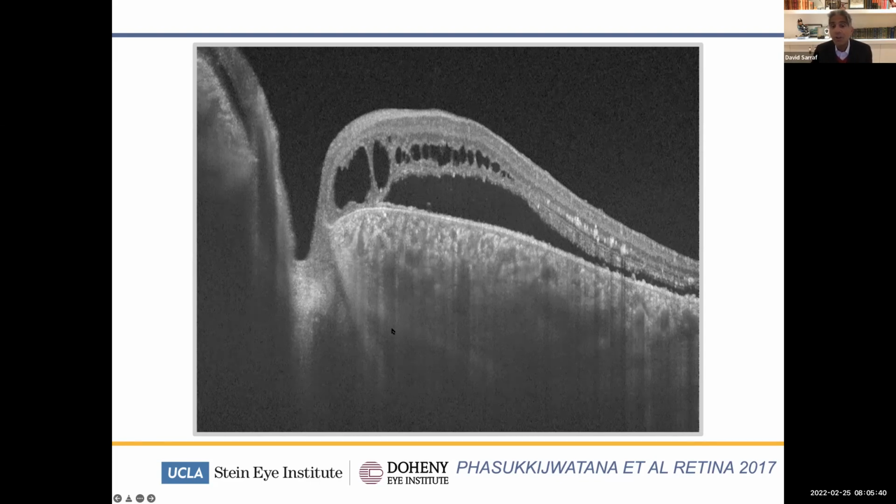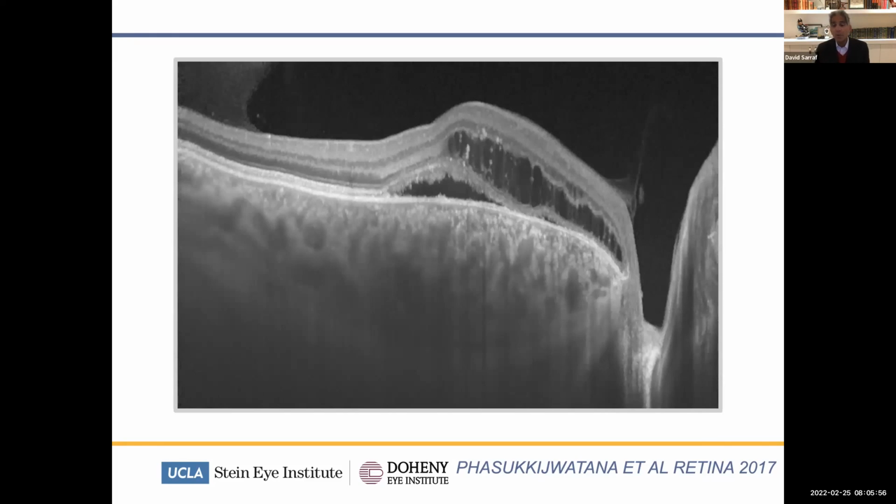And this is driven by peripapillary pachychoroid disease, or these areas of very thick choroid around the nerve, which is actually paradoxical because normally the nasal area of the macula is the area where the choroid is the thinnest. And this is a beautiful case that was loaned to us by Pierce Keane out of Moorfields in London, showing this classic pattern of peripapillary pachychoroid syndrome, in which you see this very thick choroid in the nasal macular region that's driving fluid into the retina.